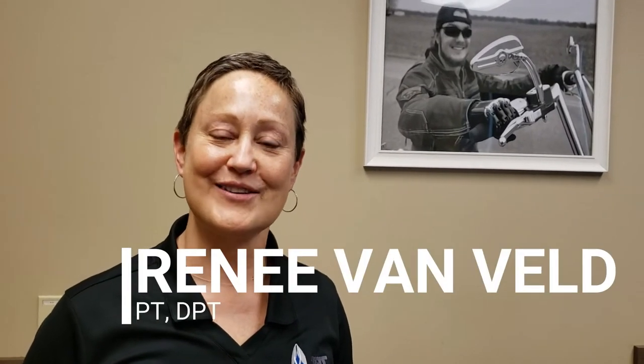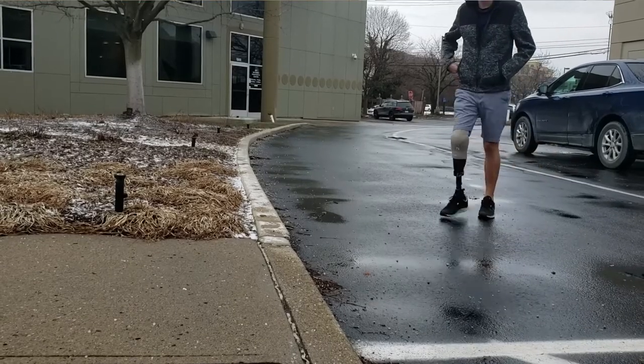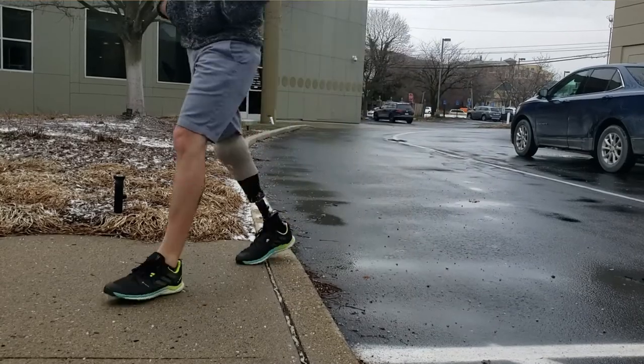Hi, I'm Renee Vienveld. I'm a physical therapist working for SRT Prosthetics and Orthotics. In this video, you'll see my friend Mark doing a variety of basic everyday functional mobility tasks using his below-knee prosthesis. These are tasks you should be practicing in your therapy sessions, so don't hesitate to ask your PT and your OT to help you work on these.